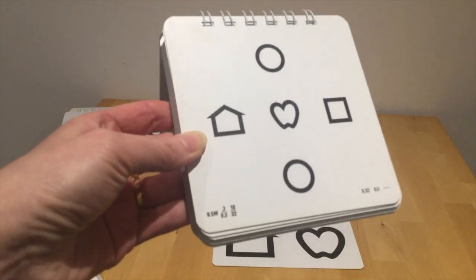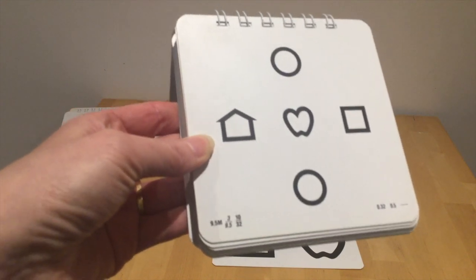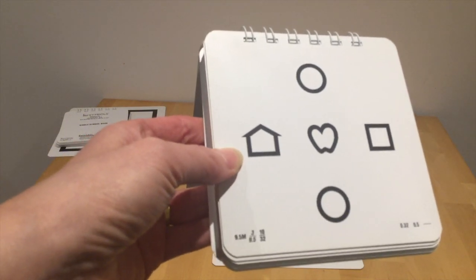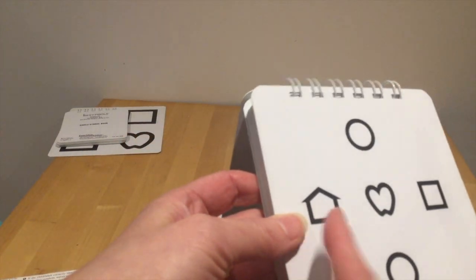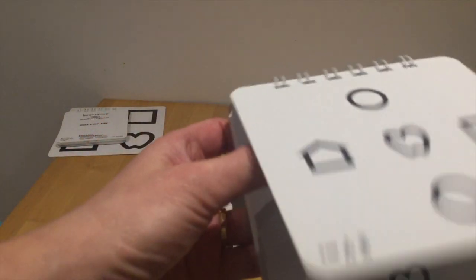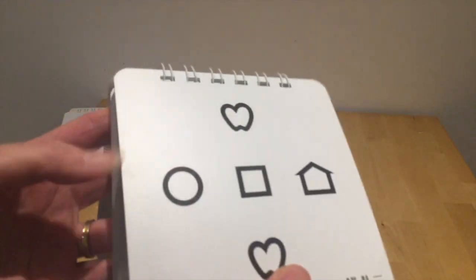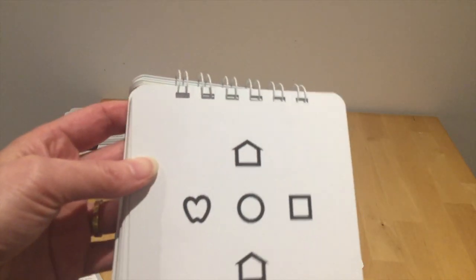And we're starting off here at 3 over 9.5. And how this is done is you are advised to ask the child what is the symbol on the left. So this one here, just beside my finger. So we're only wanting one of those shapes to be called. And again, what's the symbol on the left? So the house. This time it's a circle, so it's 3. So if they get it right, you can flip on.